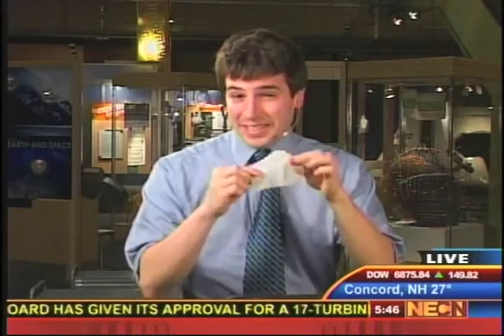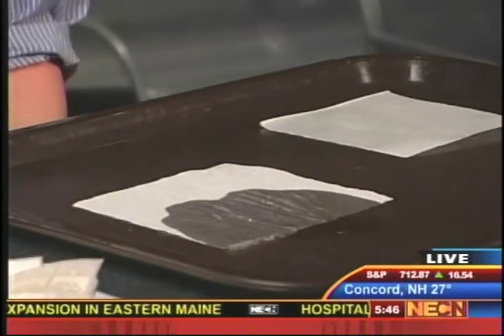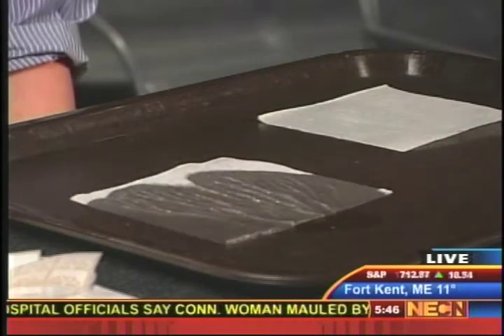Sure. So if I take this little piece of tissue paper and I drop it in my little puddle of water here, the water moves right across the tissue paper. And the key thing here is that it doesn't require any outside power to do that. So what the chemists figured was they could control the flow of fluids through the paper. And they did this by creating little tiny millimeter-sized channels in the paper.